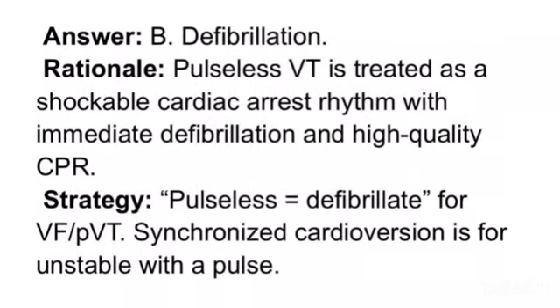Answer: B. Defibrillation. Rationale: pulseless VT is treated as a shockable cardiac arrest rhythm with immediate defibrillation and high-quality CPR. Strategy: pulseless equals defibrillate for VF/pVT. Synchronized cardioversion is for unstable with a pulse.